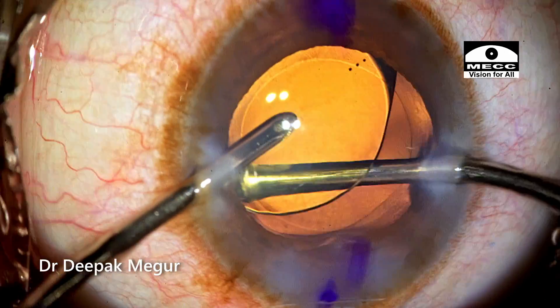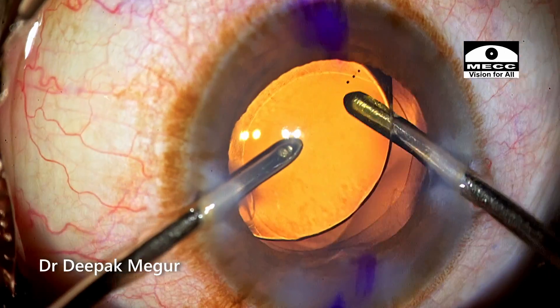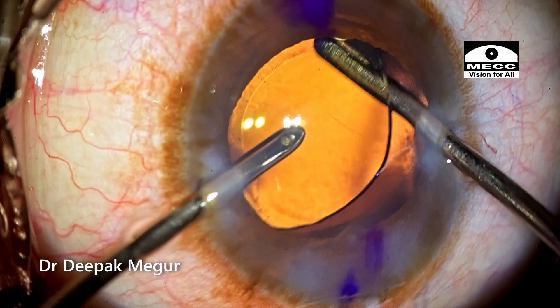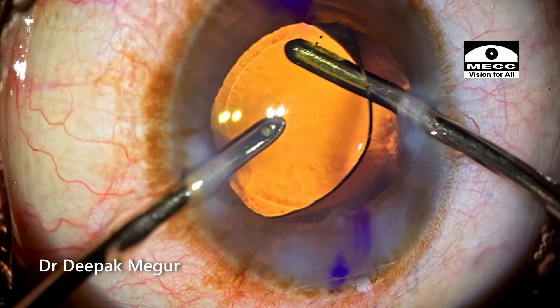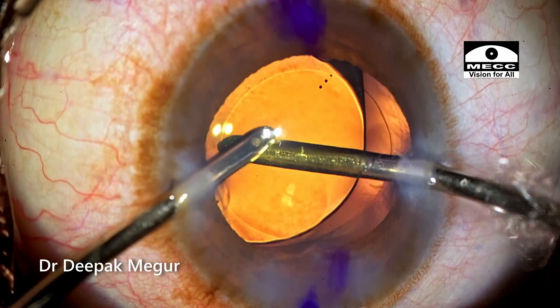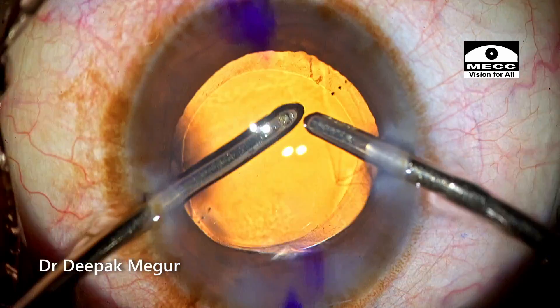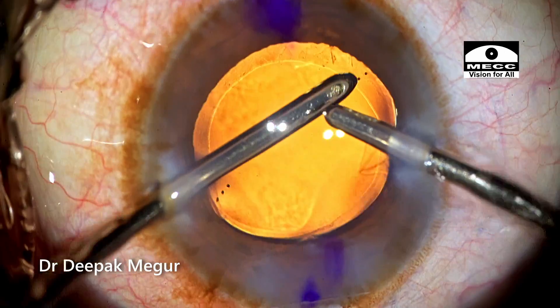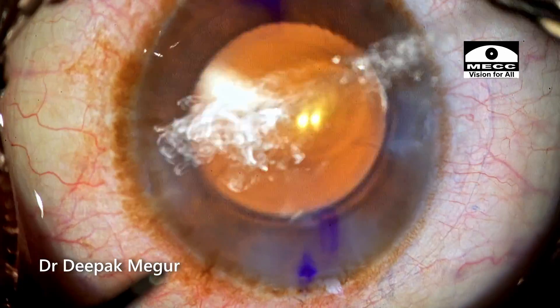It's mandatory for us to go ahead and irrigate out some of the OVD which could be sticking onto the under surface of this lens. As this is being done, I can still see the fluttering Descemet's membrane here. For toric intraocular lens, it's important that the under surface of the lens and the capsule bag is totally devoid of any OVD. This ensures a strong adhesion of the lens with the posterior capsule and ensures better rotational stability.